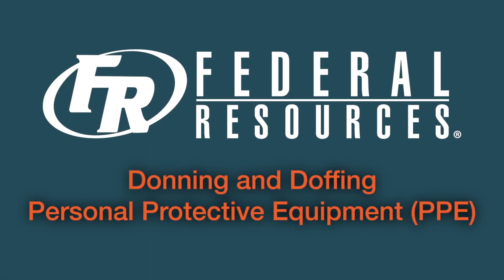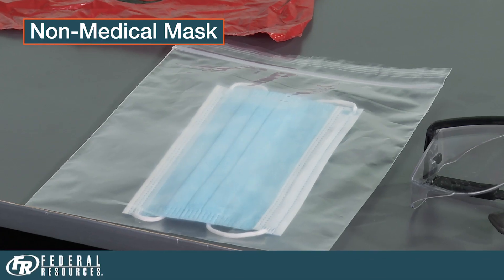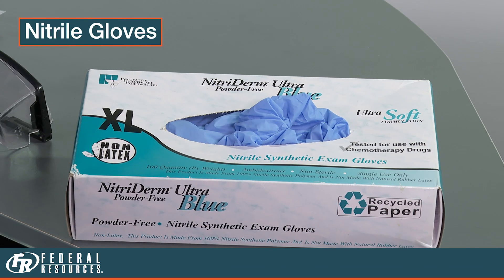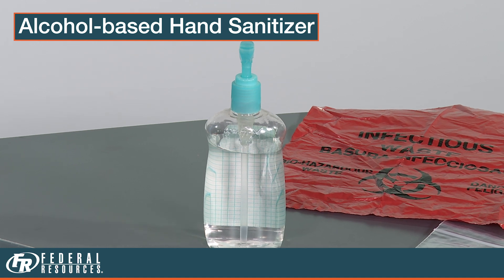The following video shows the proper donning and doffing of the recommended PPE for treating patients. First, gather the necessary supplies. You will need a non-medical mask, an impervious gown, eye protection, nitrile gloves, and alcohol-based hand sanitizer.